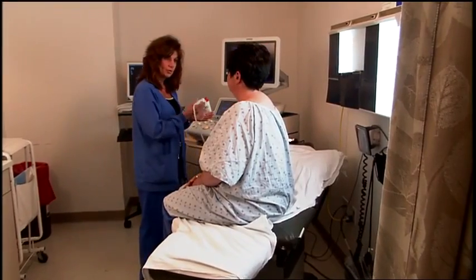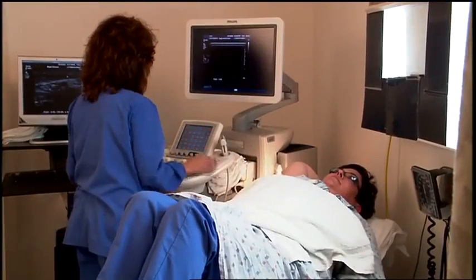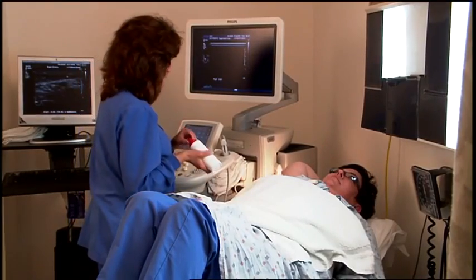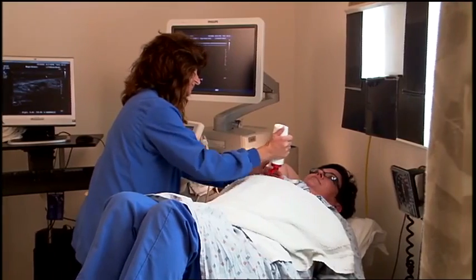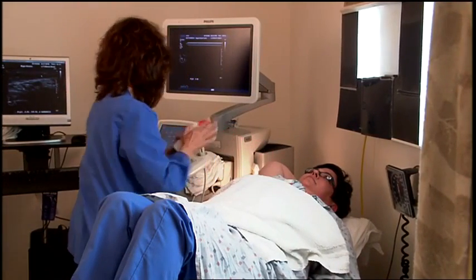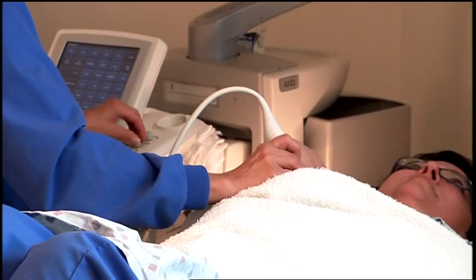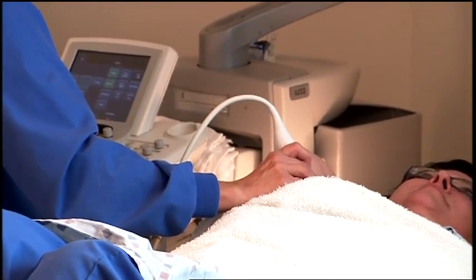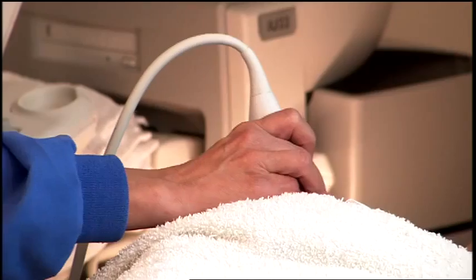During a breast ultrasound, the patient lies on her back with her arm raised. A technologist will scan the breast. A small amount of clear gel is used and a small transducer is placed on the skin and swept over the breast to image the tissues. The transducer sends out sound waves and then records the echoing waves to create an image.